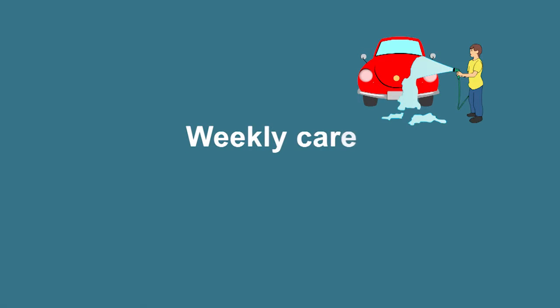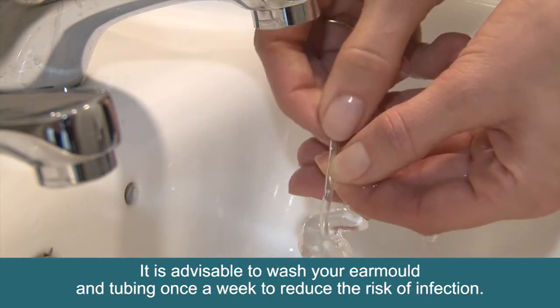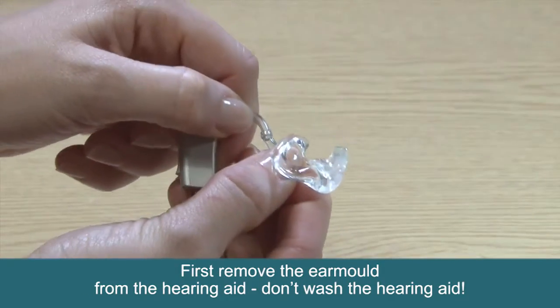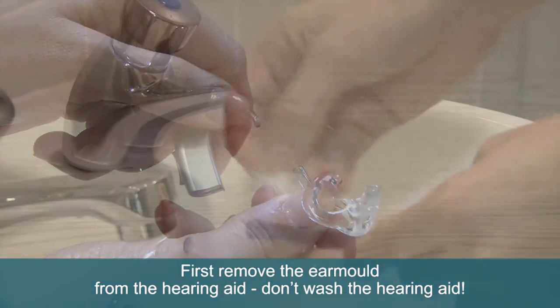Weekly care. It's advisable to wash your ear mould and tubing once a week to reduce the risk of infection. First, remove the ear mould from the hearing aid. Do not wash the hearing aid itself.